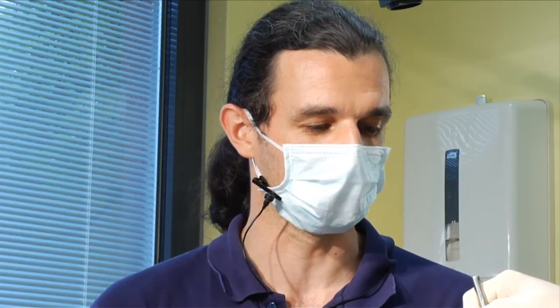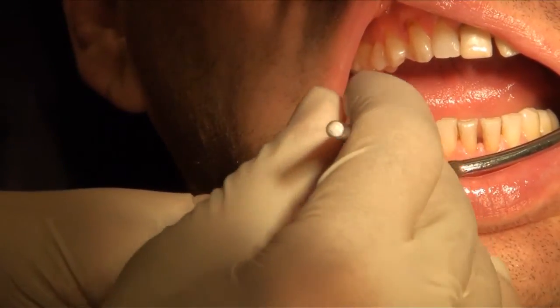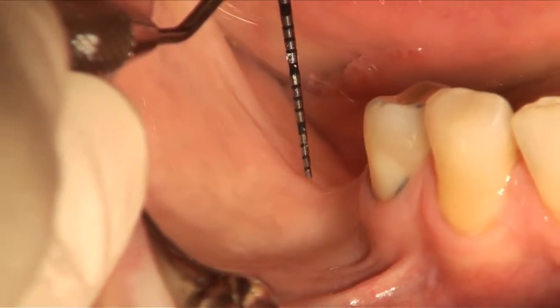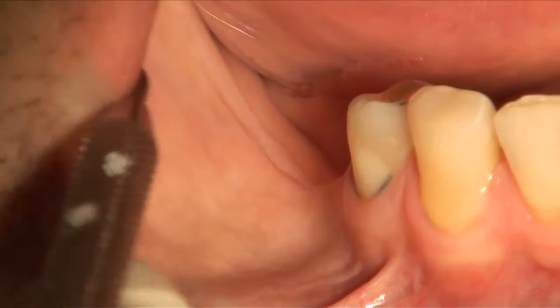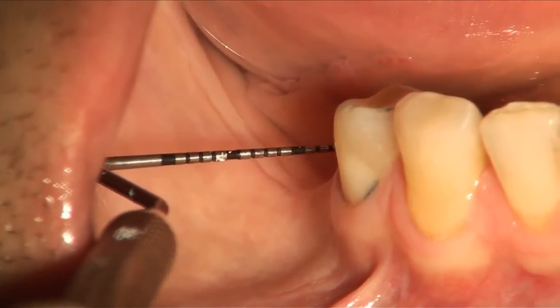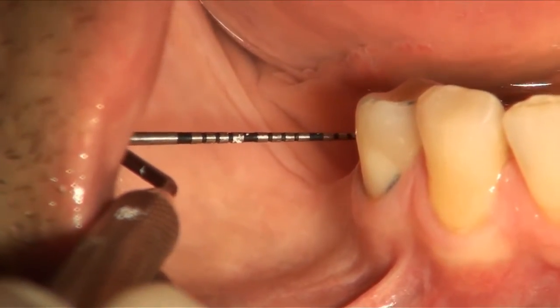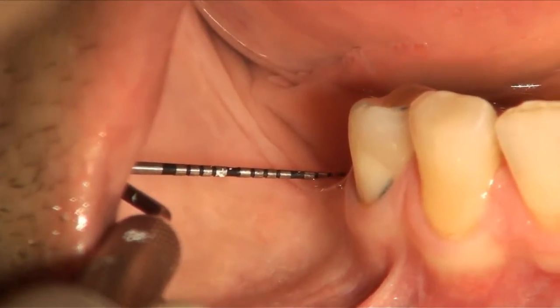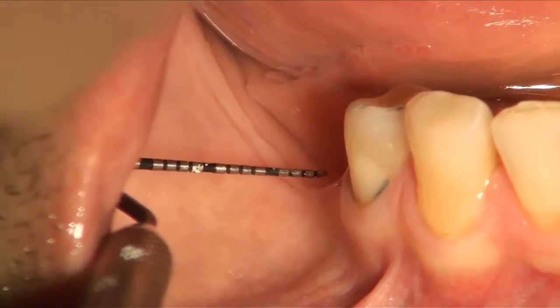We plan to perform soft tissue expansion using an Osmed tissue expander before ridge reconstruction. We see a severely resorbed edentulous ridge with approximately 6 mm deficit in the vertical dimension, and of course a corresponding lateral defect. We plan to place dental implants, and as you can see by the defect configuration, it is necessary to perform lateral and vertical ridge augmentation before placement of dental implants.